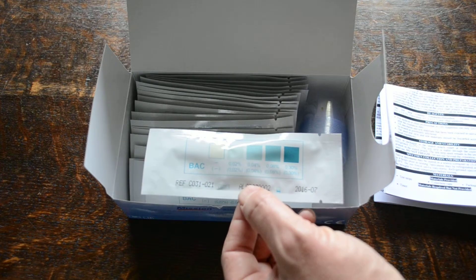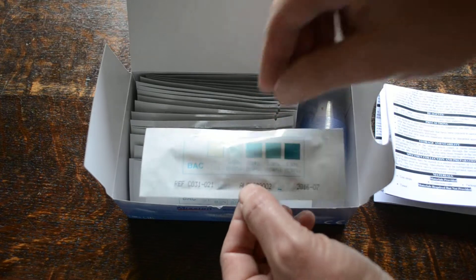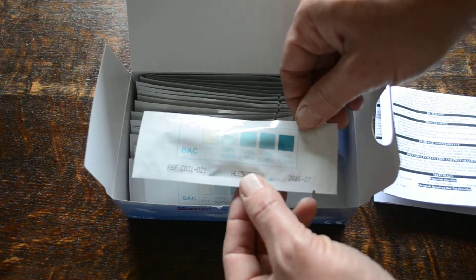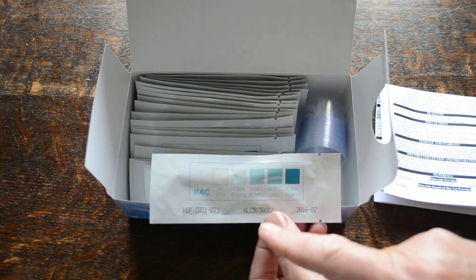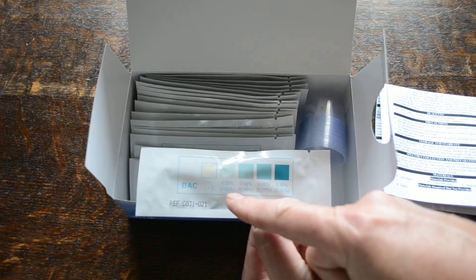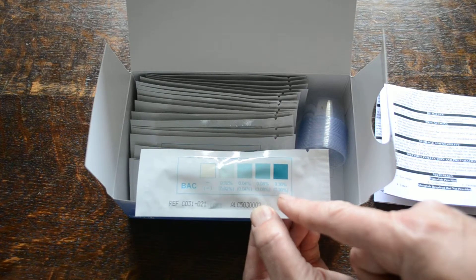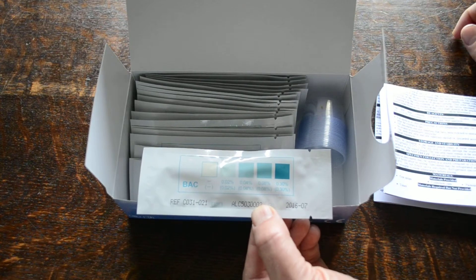You're looking for a color change of blue discoloration, and you're basically matching the color change on the pad to the color change on each of these individual foils for the nearest match. That gives you one of five predetermined readings: negative, where the pad stays a light creamy color; 0.02% blood alcohol equivalent; 0.04% and above; 0.08%; and 0.3% and over, which is obviously a high concentration of alcohol.